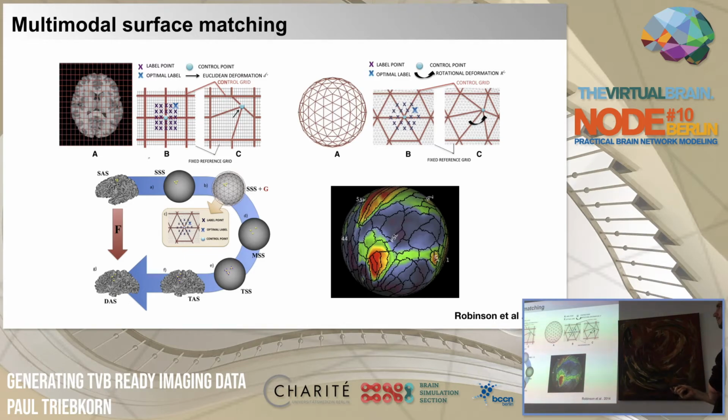So this is what was done originally or traditionally. On a surface, you move around vertices, which is easier because it's in 2 dimensions, but the principle is the same, right? This is one voxel point here, or one grid point, and you move it in the direction of x, where some cost function is best minimized. Here it is similar. You move then, but just on the vertex or on the vertices.